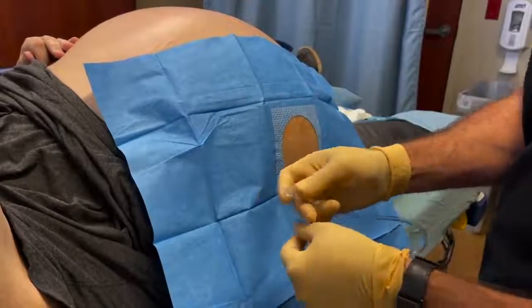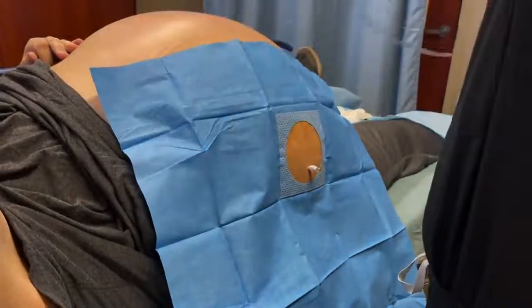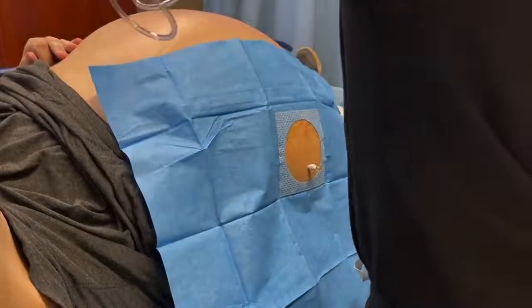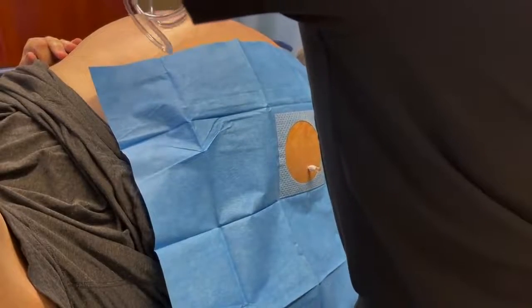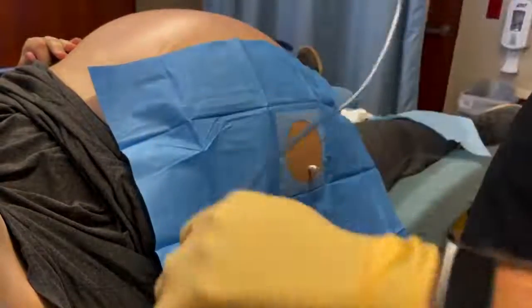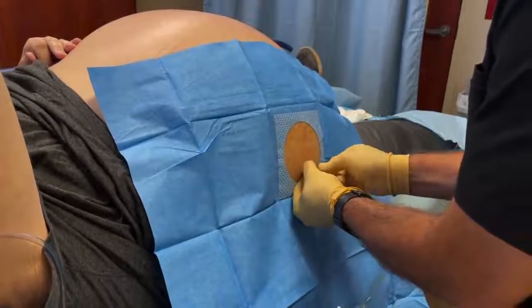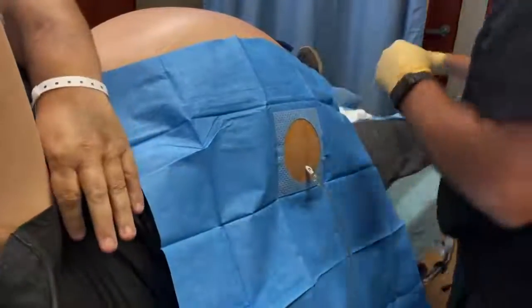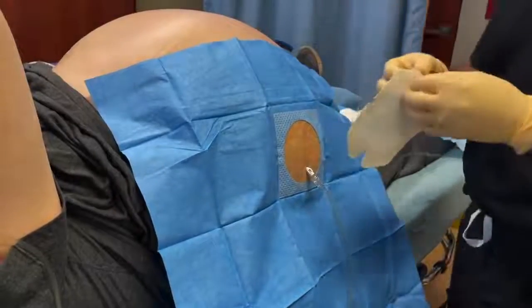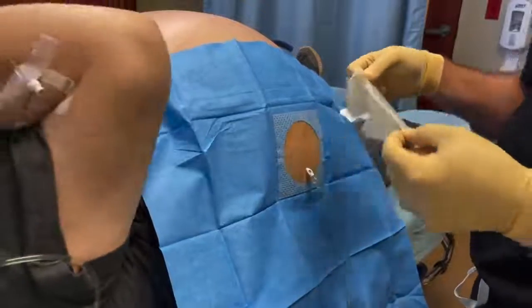This is just like an IV cath. It hooks up here. This goes to the nurse, it hooks up to the suction. You don't need that one. This will go straight into that. And then when we hook it up, it starts going up. I guess it'll be better for me to put my arm down. You can put it in front of you, just don't touch the blue area.